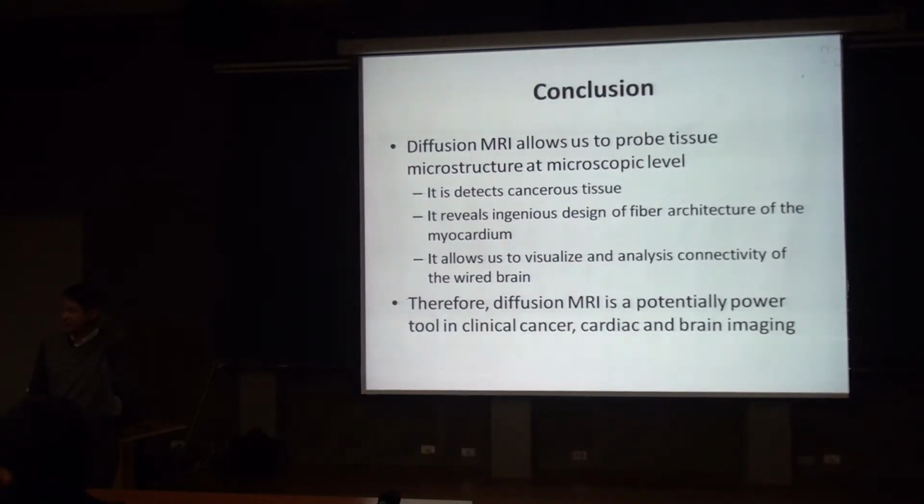Well, it is really very impressive that we can now map out the tissue in our brain and in our heart in such great detail. Okay, so any questions? Did you find any major difference between the left and right hand side brains of normal people?